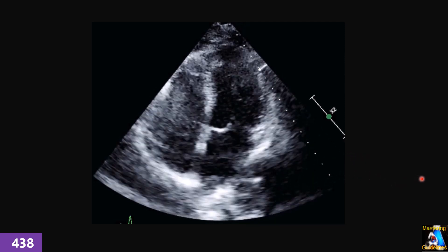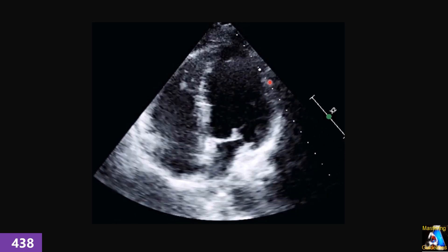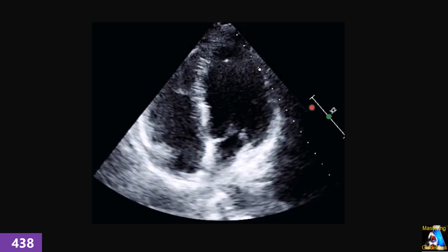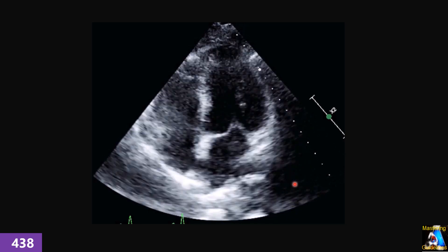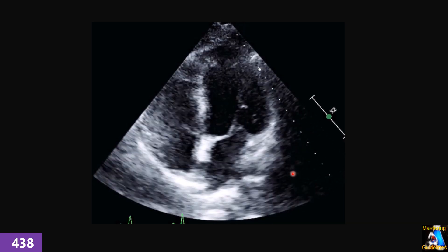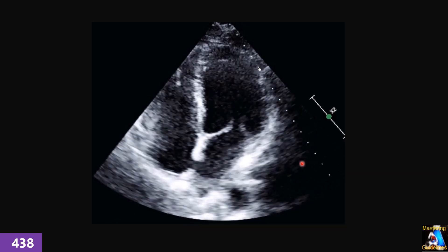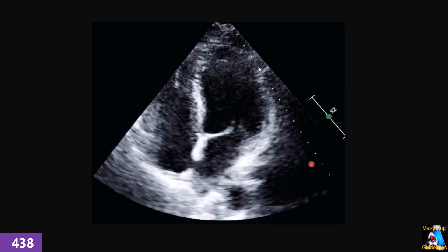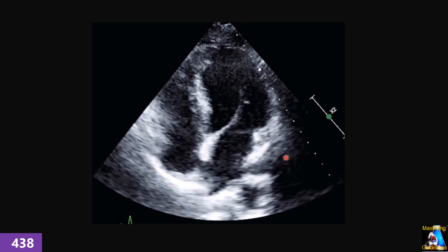I prepared this one again as a reminder. Here we have an apical four-chamber view. Besides optimizing the image — compression, compounding, gain, and all those settings — what is wrong with this apical four-chamber view? What is your landmark or reasoning that something is wrong? Can we do a Simpson measurement in this case? Why not? And finally, how do you fix it?